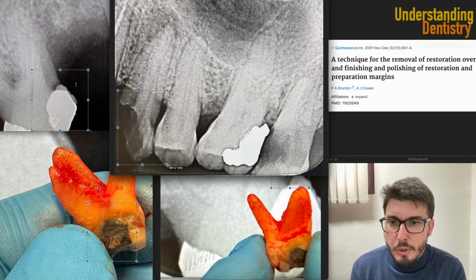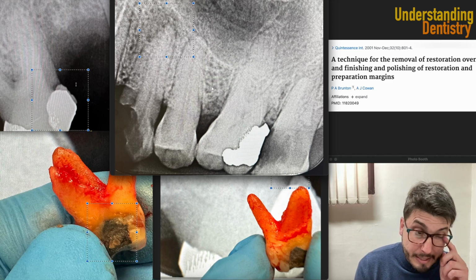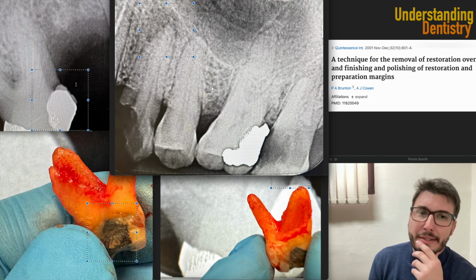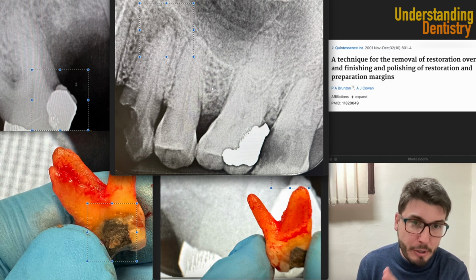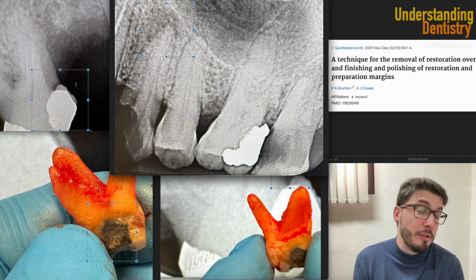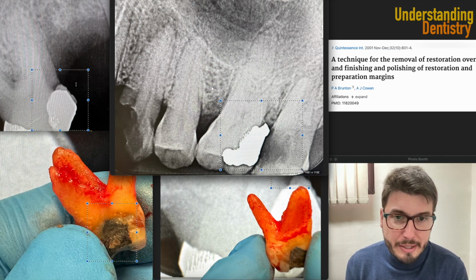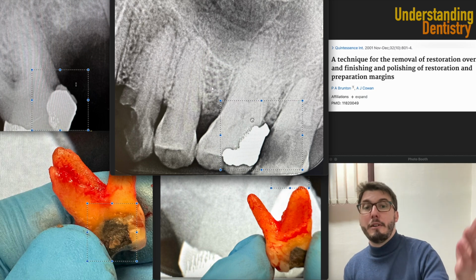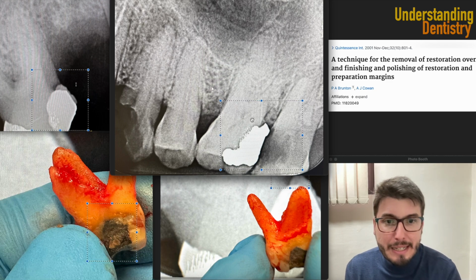And then also this situation of the premolar, where we can find a radiolucent lesion with ill-defined limits, and that's a radiographic periapical abscess. So not yet a granuloma, because we have ill-defined limits, and that's an acute alteration of the bone, not yet chronic as a periapical granuloma would be. So in this case, extraction of both teeth, we cannot do anything else, because you are never going to be able to restore those areas now, not only below the gingival tissue, but also very close to the alveolar crest, even below the level of the alveolar crest in some areas, so we cannot just restore that. Unfortunately, that's the problem.